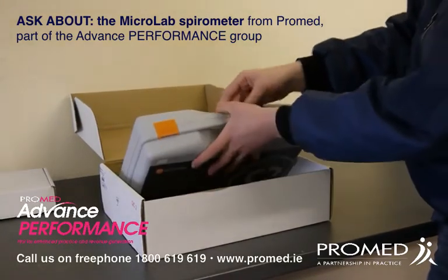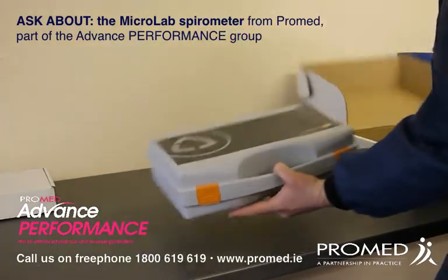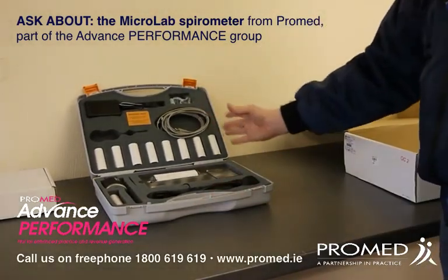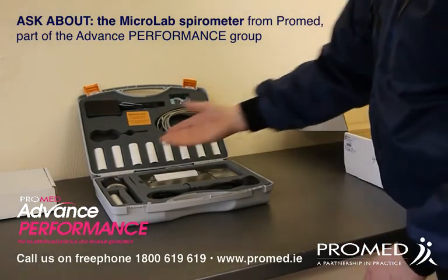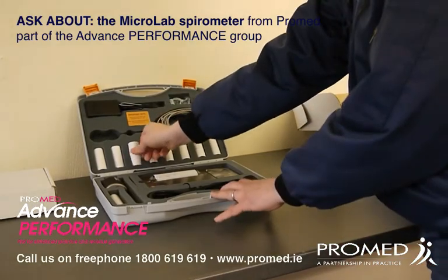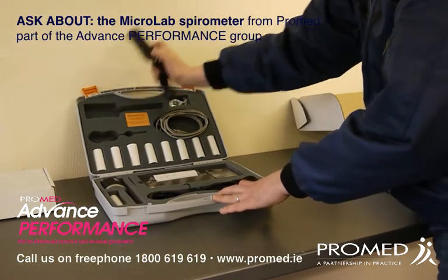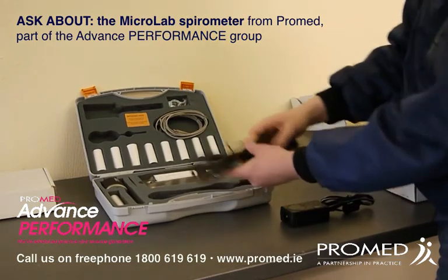Your product comes in a very sturdy and durable case. Opening this, you'll be able to see the contents inside. It comes with USB cables and everything that gets you started with your product, including your mouthpieces and your nose clip, and also your transformer for recharging and your electrical cable to recharge.